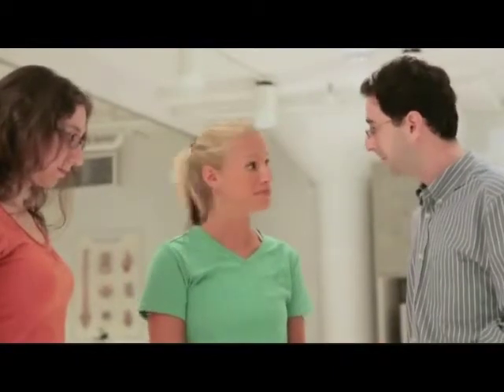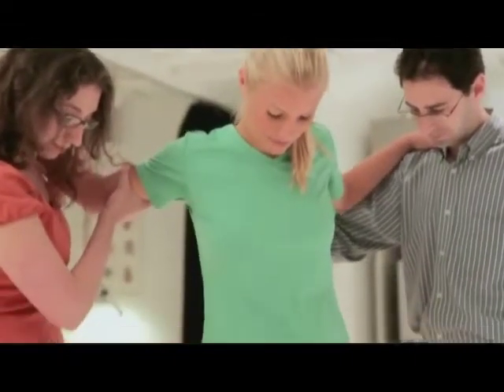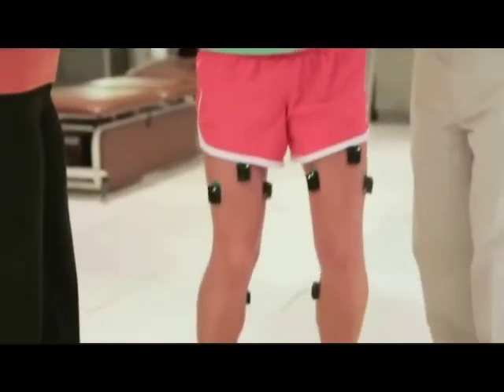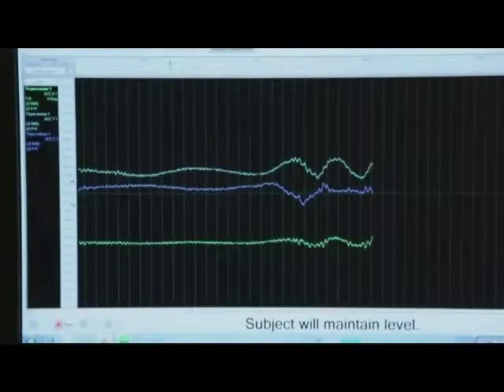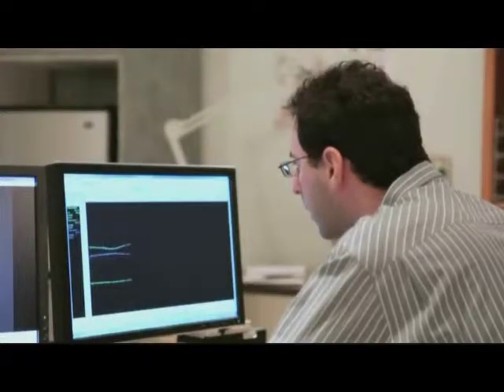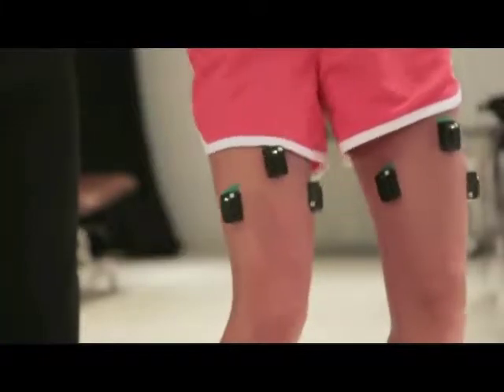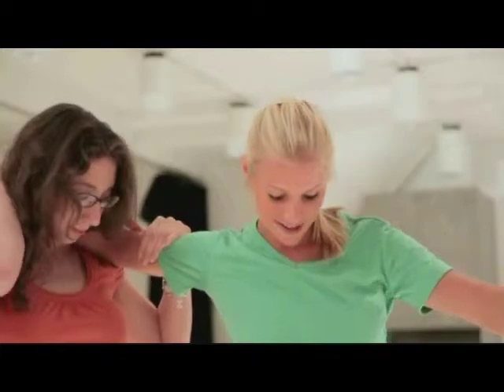In a follow-up session, Dr. Walker tells Monica they are going to have fun. He reminds her about the wobble board and instructs her that her goal is to stay as steady as possible. They will use the accelerometers to assess smoothness. Monica tries the wobble board and confirms it is indeed fun.